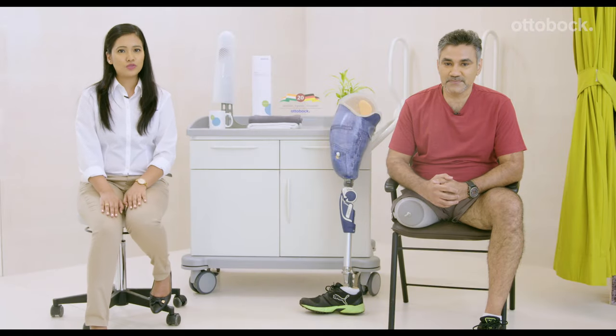In this video, we are going to show how to put on a pin liner and shuttle lock socket. My name is Pooja and I work here as a CPO in Ottobock Clinic, Mumbai. I'm Derek and I'll demonstrate to you how to wear the prosthesis.